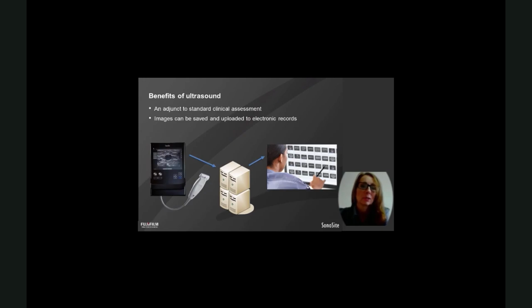Some of the benefits of ultrasound that I've seen: it's an adjunct to standard clinical assessment. It's another tool in our toolbox that helps us to do the assessment and also to cannulate. We can capture images and save them for future reference.